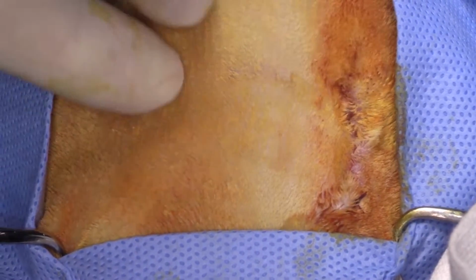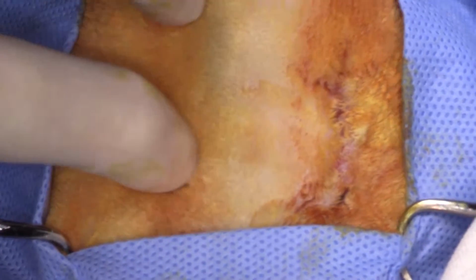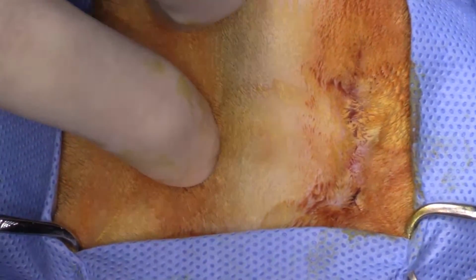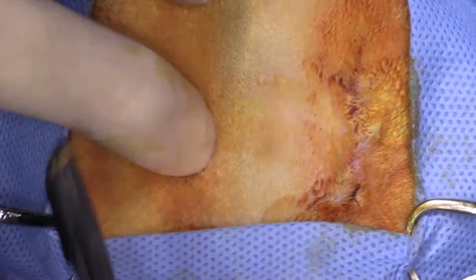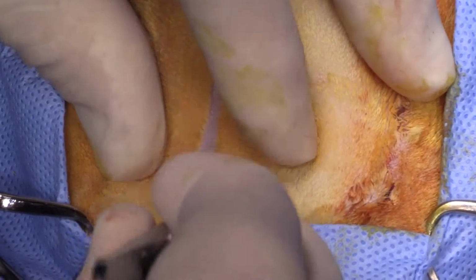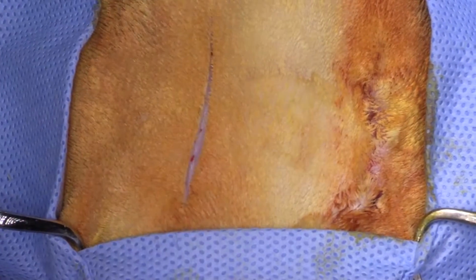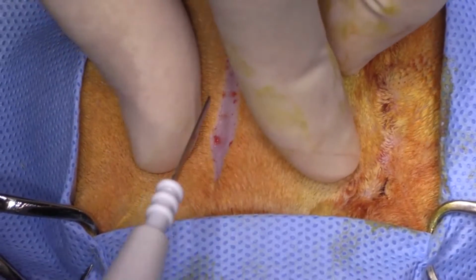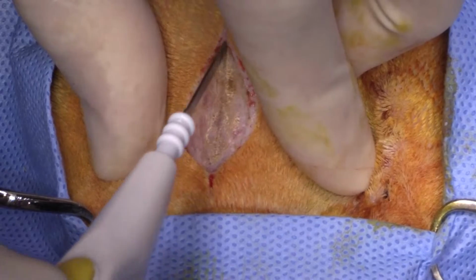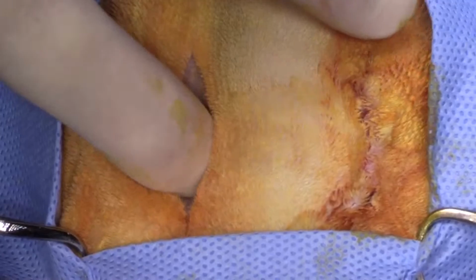All right, so now coming in on this side, the bulla is sitting right here. So I assume that you can see that. Can I get a blade? All right, so I'll make my skin incision right over the bulla this time, instead of over the ramus of the mandible. Through the platysma muscle, and then I'm palpating down onto my bulla again.